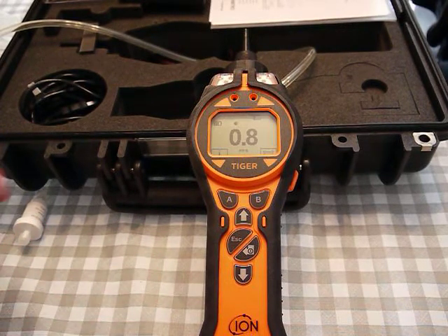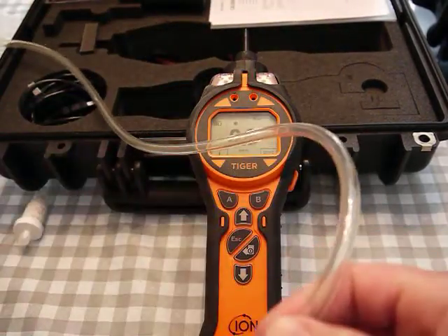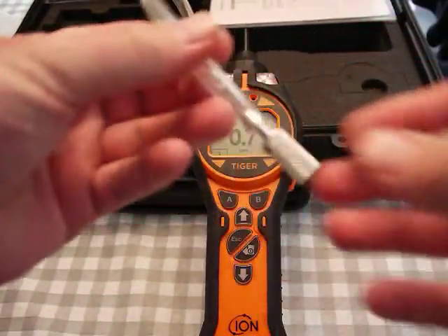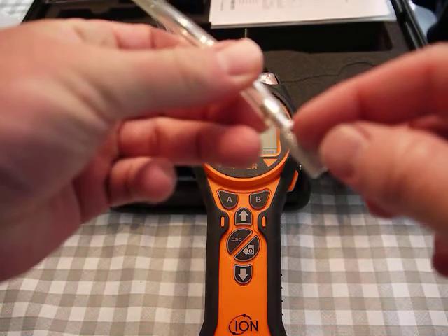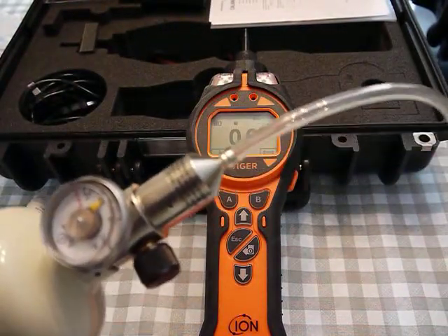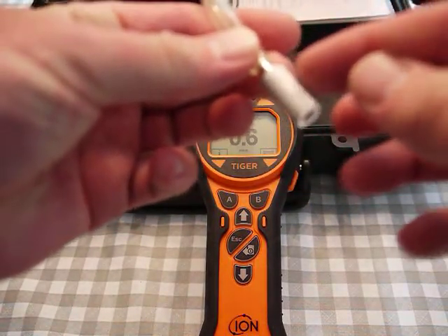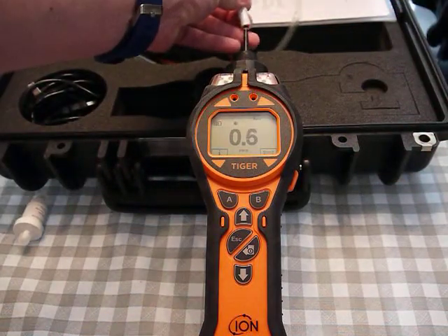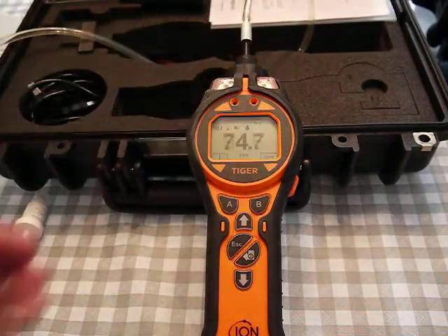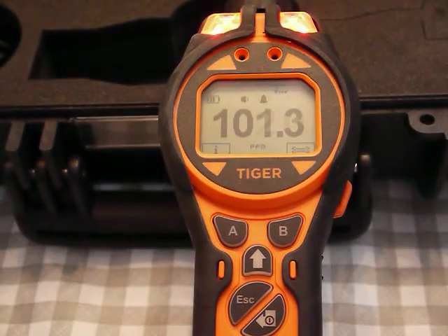For the bump test I have 100 ppm isobutylene gas and a fitting with little holes. The regulator is a 0.5 liter per minute regulator, so it's going to flow at 0.5 L/min and the excess gas flows to those little ports so it doesn't overpower the pump.